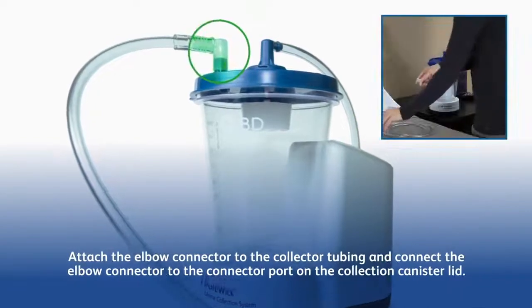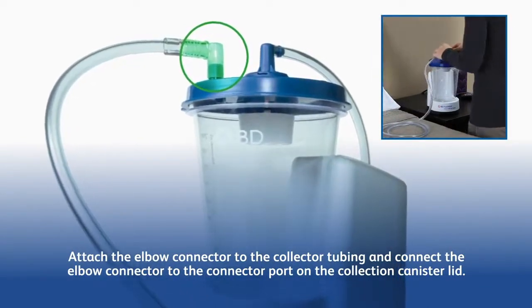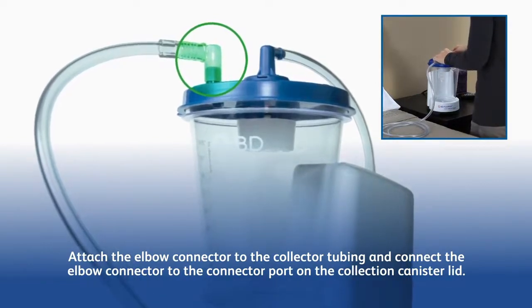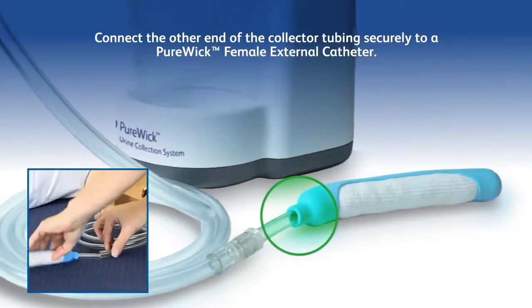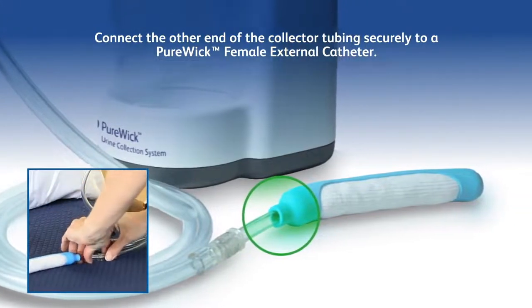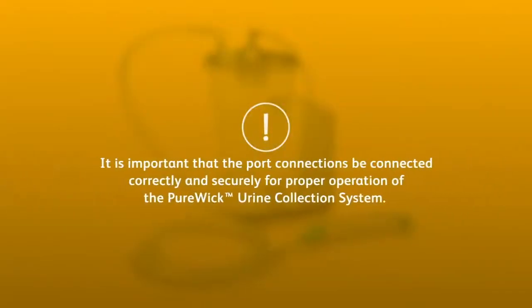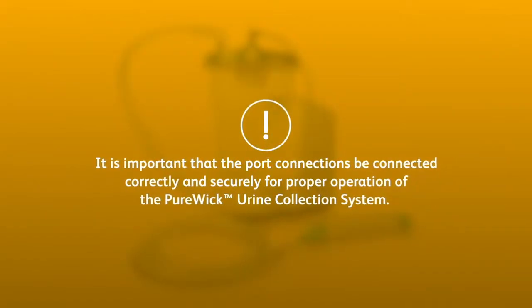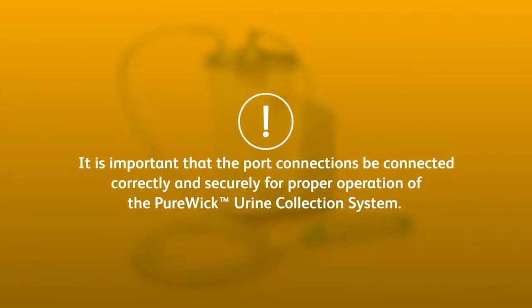Attach the elbow connector to the collector tubing and connect the elbow connector to the connector port on the collection canister lid. Connect the other end of the collector tubing securely to a Purewick Female External Catheter. It is important that the port connections be connected correctly and securely for proper operation of the Purewick Urine Collection System.